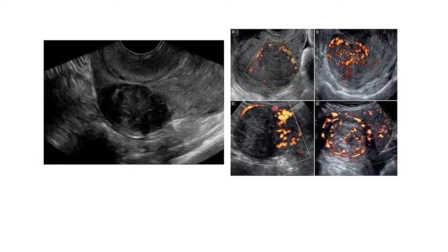So this is another fibroid there. You can see that there's peripheral vascularity that you're seeing there. So that's this one. At times when you see blood flow inside a fibroid, it will mean that that fibroid has transformed into cancer. So at times fibroids can transform and become cancerous.